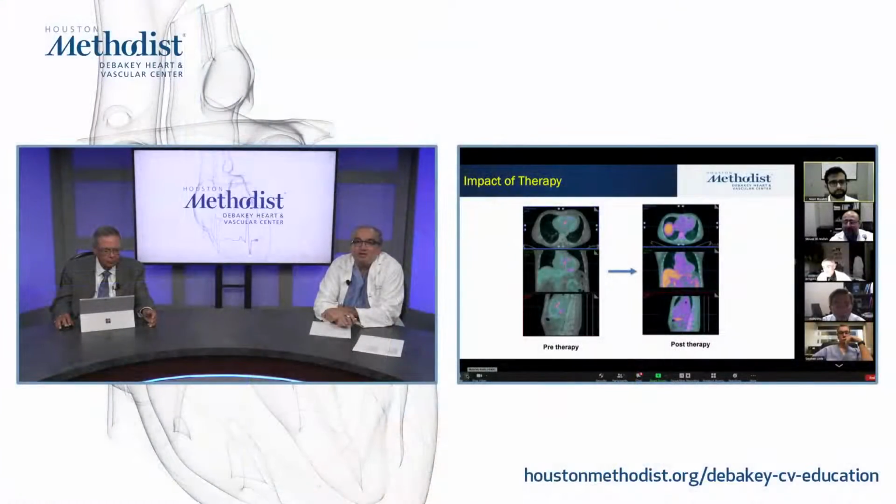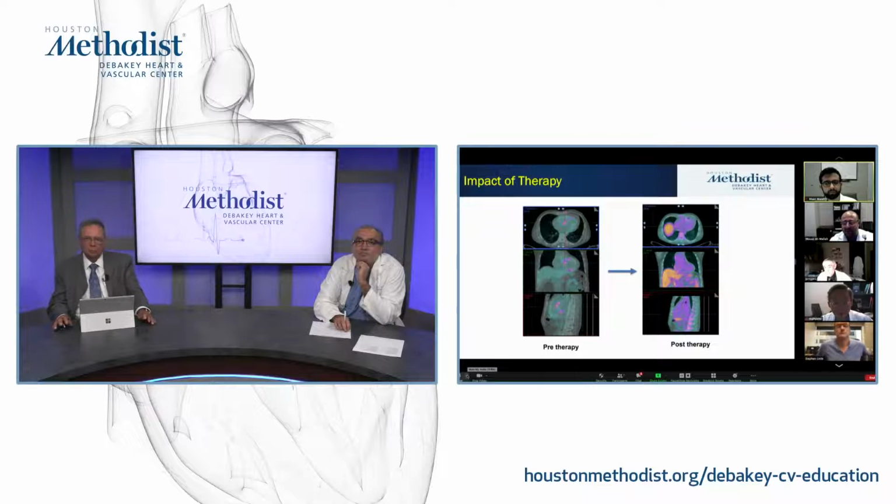Yeah, that's a very good question. And yes, there is something in the pipeline. It's in the second phase 3 trial, and we are participating in this trial. And maybe a pitch to everybody who's listening: if you have somebody that you can refer to us who will be willing to undergo a SPECT and PET and they're going for cath, yes, we would like to get this study going and hopefully get this approval. It's an F18 based agent called flurpiridaz. For disclosure, it's not yet FDA approved. This trial is going to hopefully get it to approval, and it will hopefully allow us to do exercise perfusion because of the longer half-life of F18 agents.